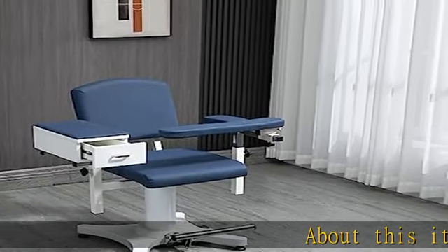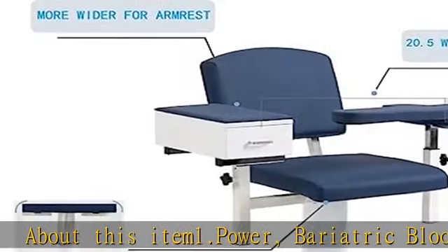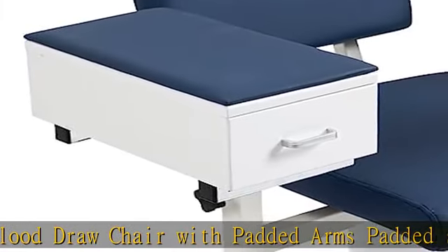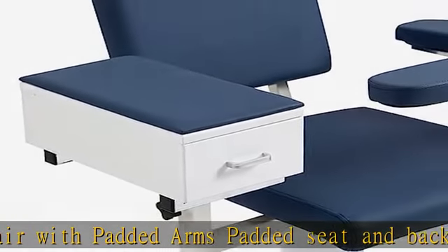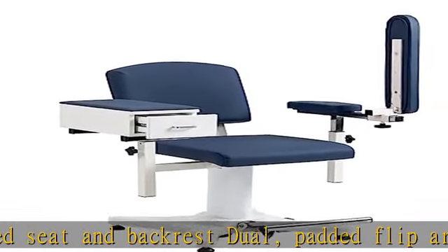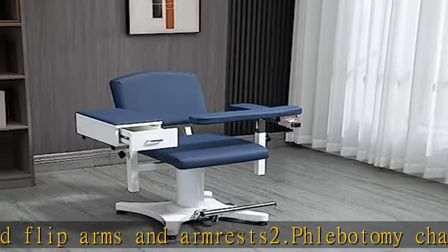About this item: 1. Power Bariatric Blood Draw Chair with Padded Arms, Padded Seat and Backrest, Dual Padded Flip Arms and Armrests. 2. Phlebotomy Chair Dimension: Seat Width L21.5 x W19.2, Height Range 19–26.8. 3. Blood Drawing Chair is easy to clean with durable upholstery, designed for patient comfort with thick foam.